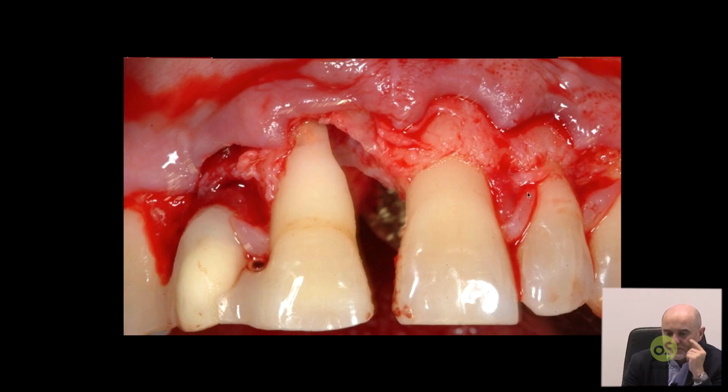And since from the oblique incision to the tip of the anatomic disepithelialized papilla there is always a 2-3 millimeter distance, we can coronally advance our flap, so get our flap free from muscles in order to make this papilla coronally advance 2-3 millimeters and be fixed above the anatomic papilla.